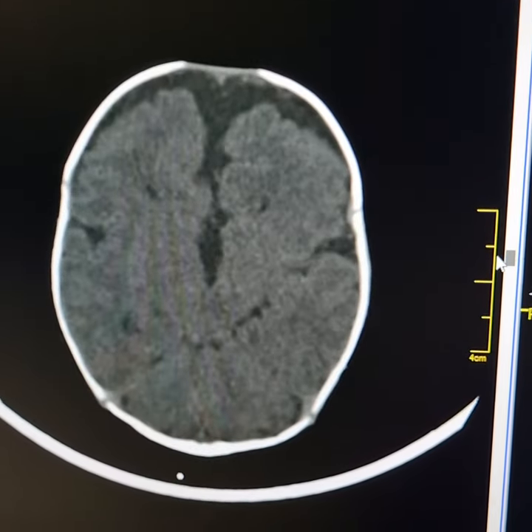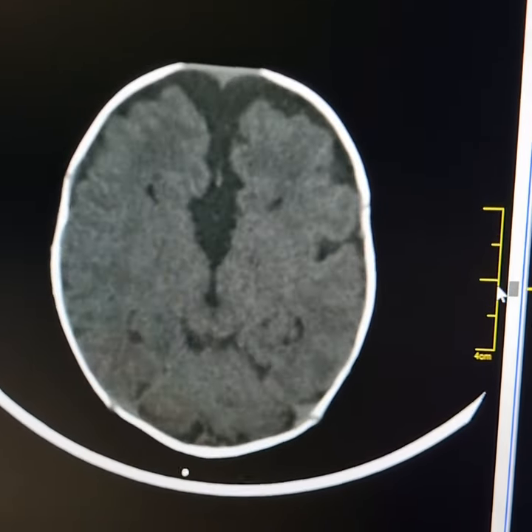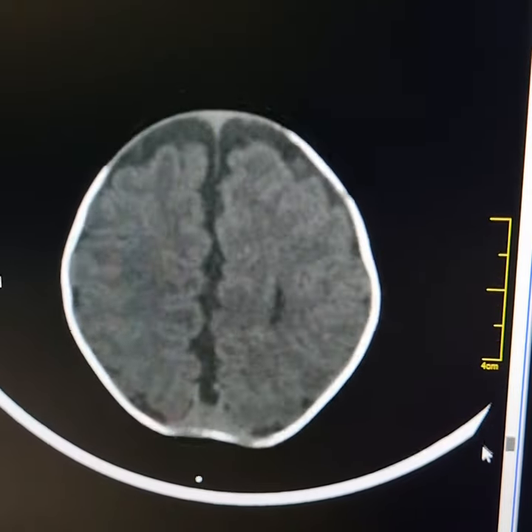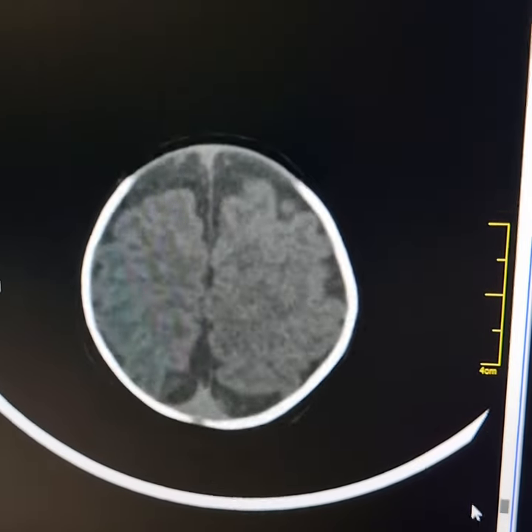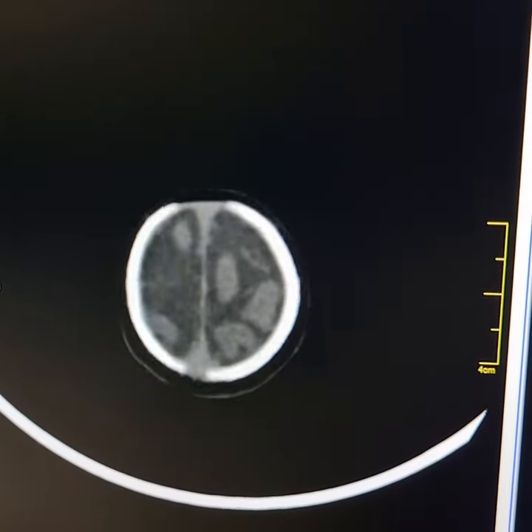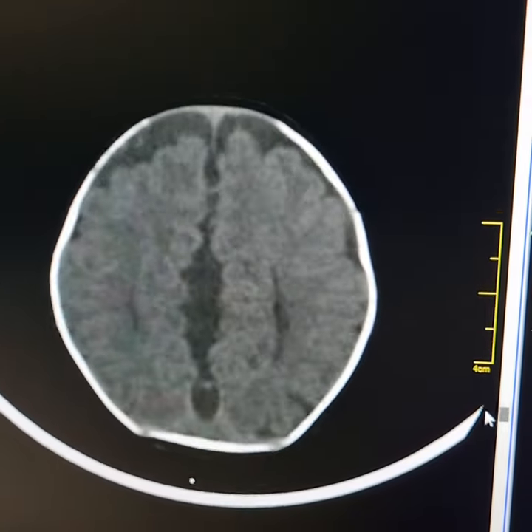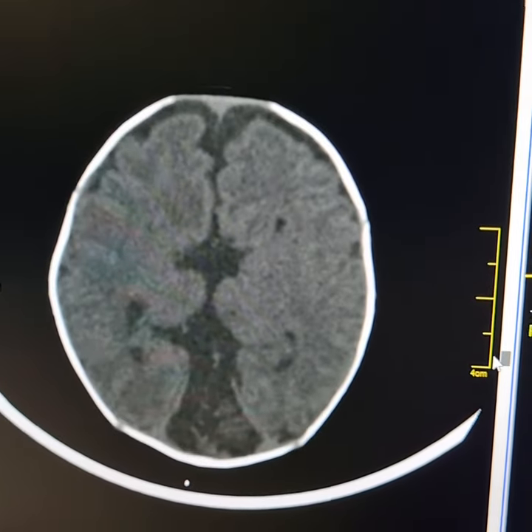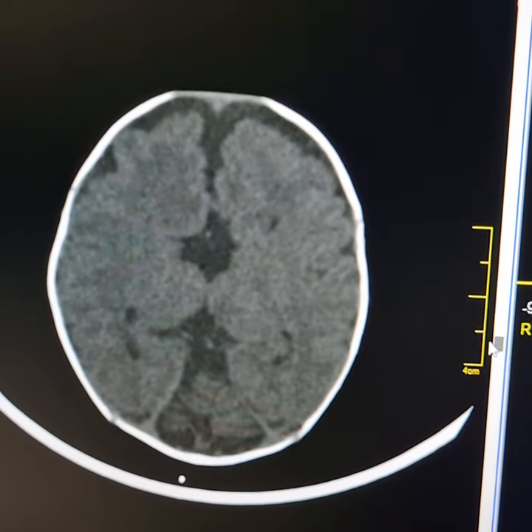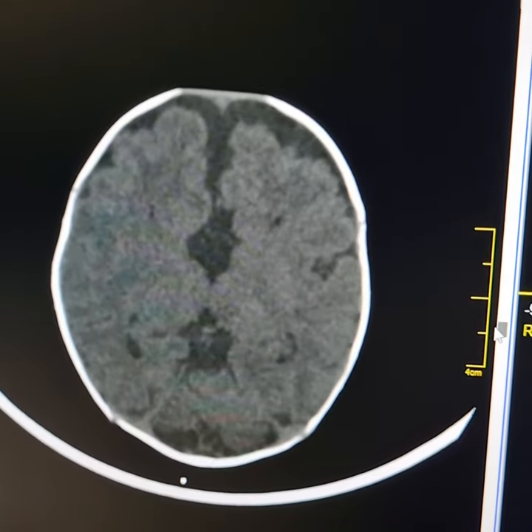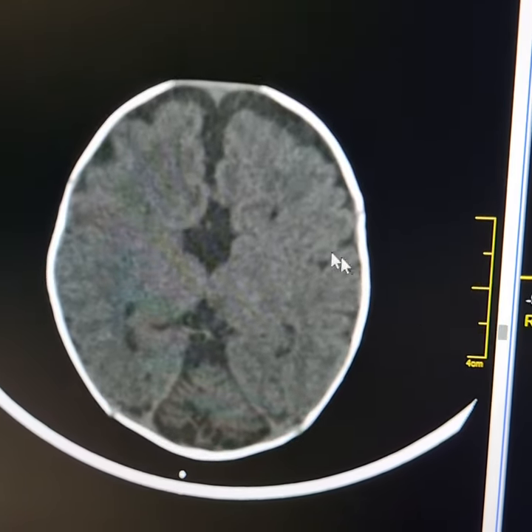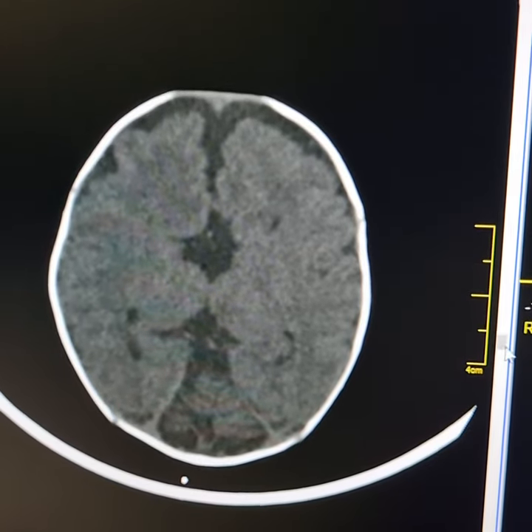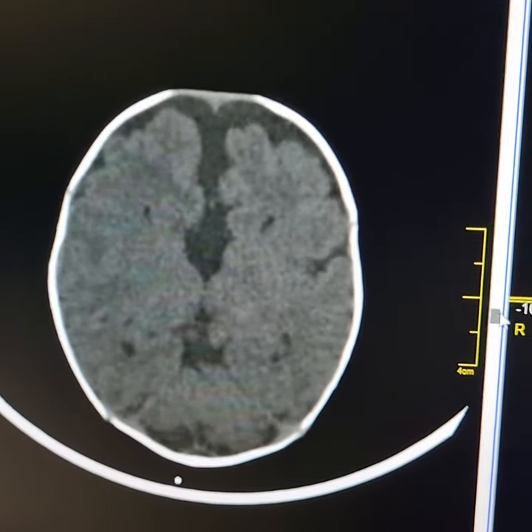First I scroll it up to the vertex, then I will show you further details. Please observe that there is mild dilatation of extra-cerebral CSF spaces. There are focal areas in the parietal region in both parietal lobes.